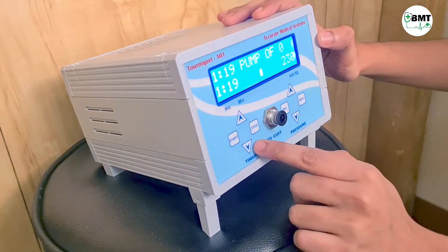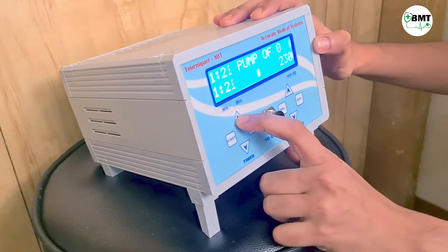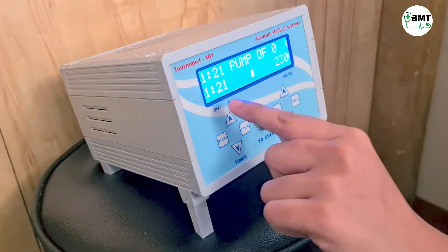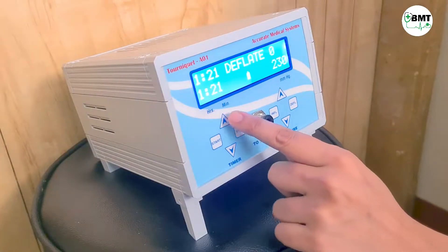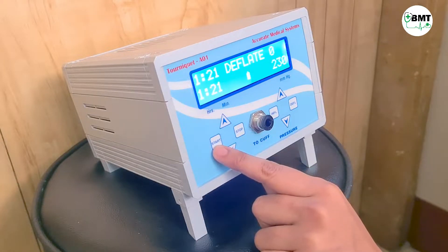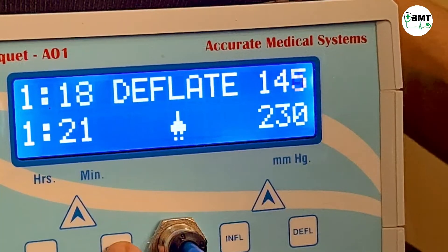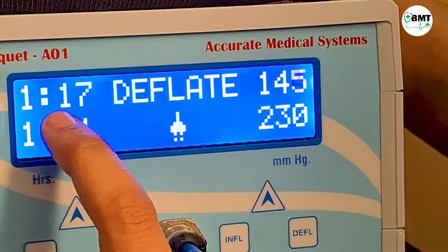From here you can set the timer, and from here you can set the pressure. The downward reading is the set value and the upward reading is the value achieved. You can increase or decrease the timer from here, and you can start and stop the timer. The blinking indicator means the timer has started; if you press stop, the timer will stop.